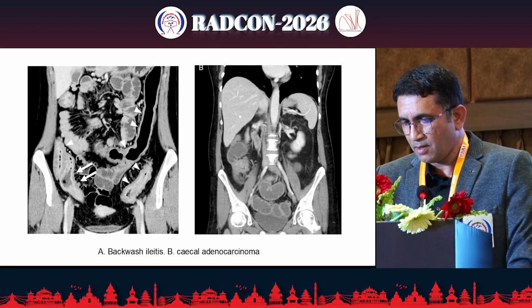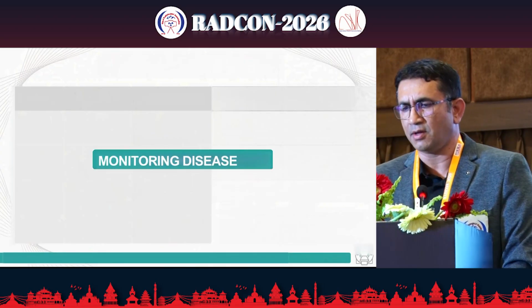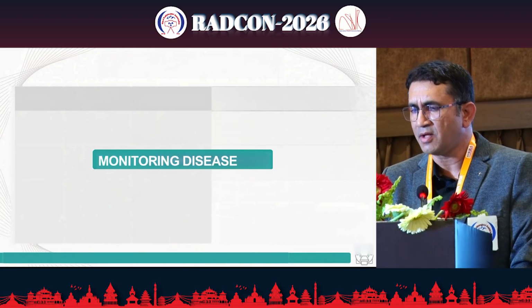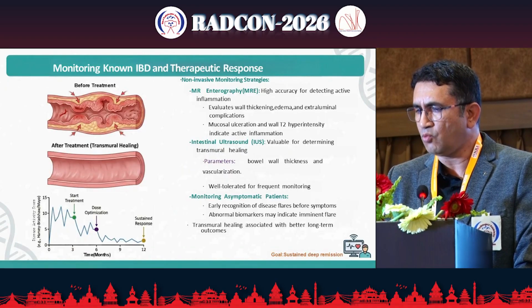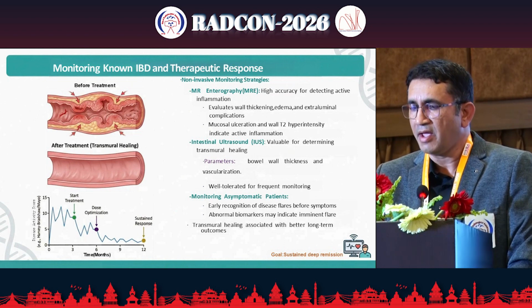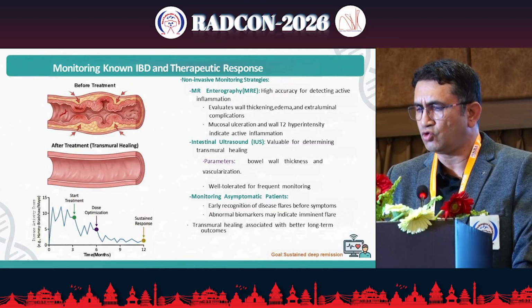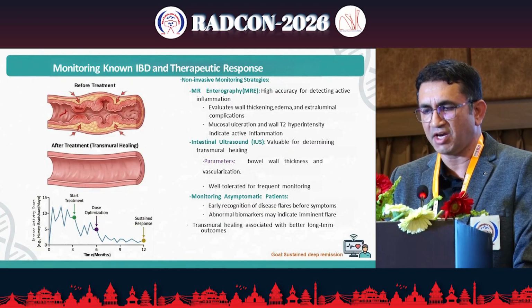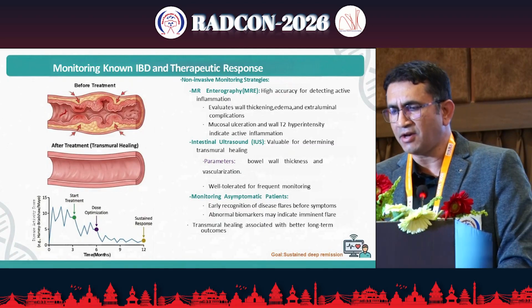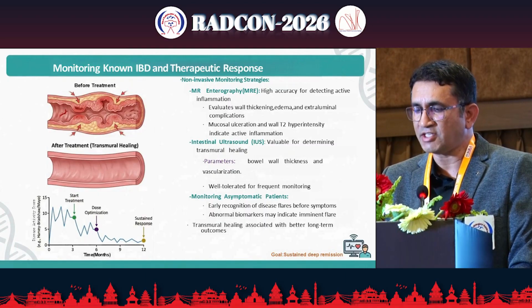Again, monitoring the disease in IBD is quite important in case of therapeutic response. In MR enterography, normally we look for bowel wall thickening, edema, and extraluminal complications. And we look for T2 mucosal ulceration and wall T2 hyperintensity, which indicate active disease. Intestinal ultrasound is quite valuable for determining transmural healing.